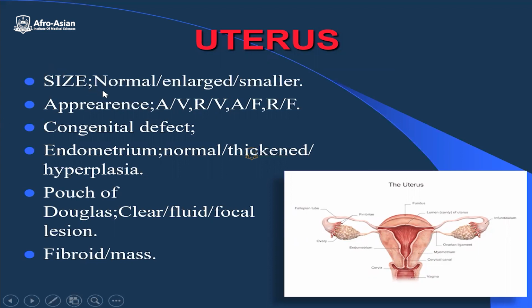So size is important. In an adult woman, the normal size is from 6, in some books 5.5 centimeters, to 10 centimeters.